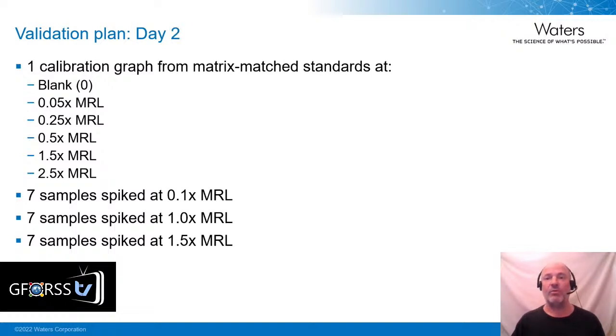And then on day 2, we repeat the process. So prepare calibrants and prepare the spikes in exactly the same way as day 1, and then analyze them. And then on day 3, the same again.